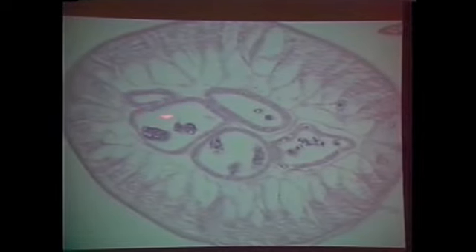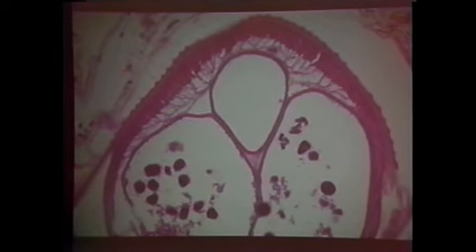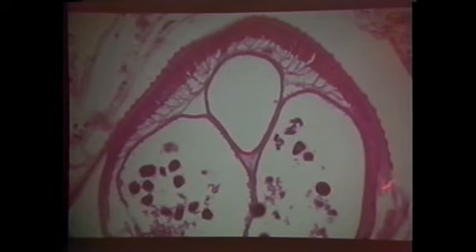These are four cuts of a uterus. Pretty worm, huh? Male or female? Female, female. Male, male, male. But look at the pretty coelomyarian muscles. Low lateral cords. That was Dirofilaria immitis. Some Dirofilaria have these ridges on a cross-section, and they're called external longitudinal ridges.